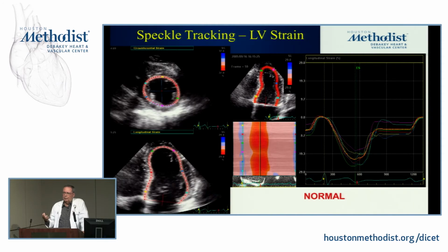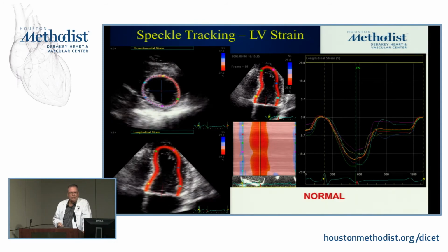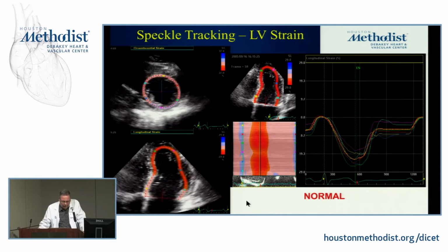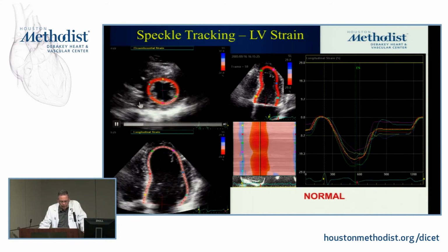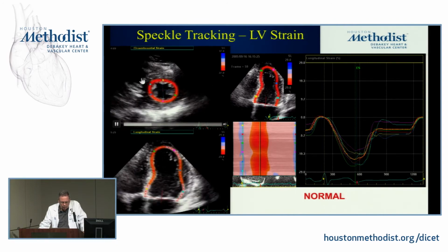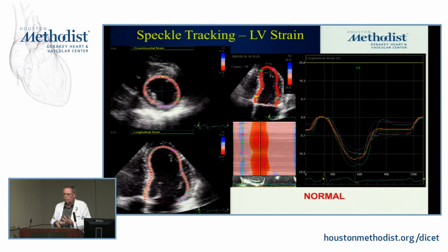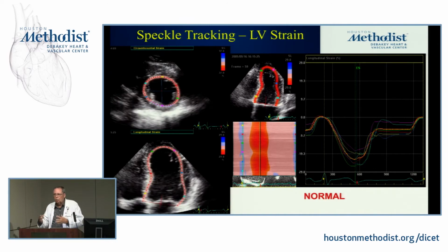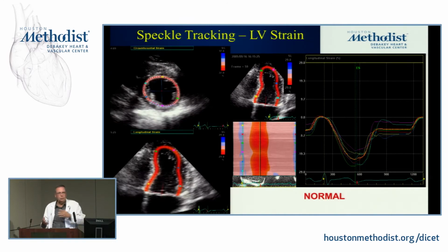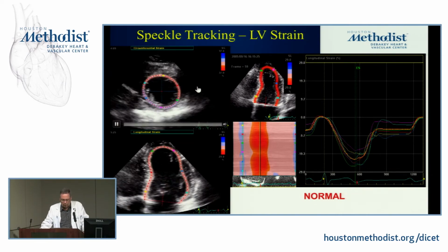I started my career with M-mode trying to look at myocardial function, doing stuff that took me a day for one patient. And this does it in a microsecond. So what we're seeing here is speckles moving and tracking either longitudinal vectors, radial vectors, or circumferential vectors. So you can do circumferential, radial, or longitudinal. Today, for global function, we tend to rely a lot more on the longitudinal, which is the one we see almost in every case in the lab, if the images are reasonable in quality.